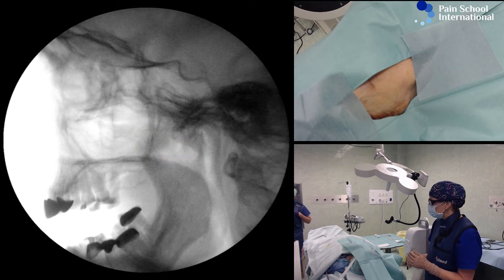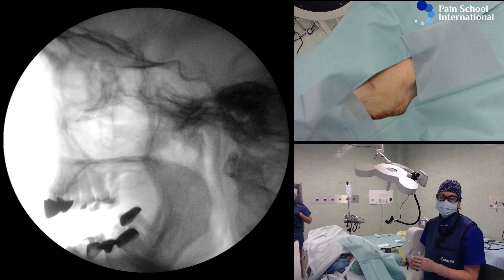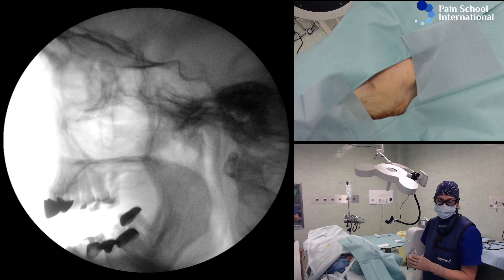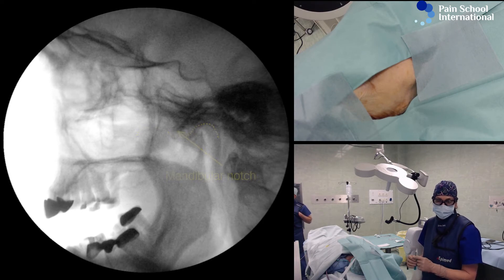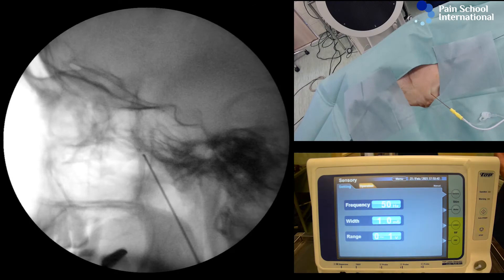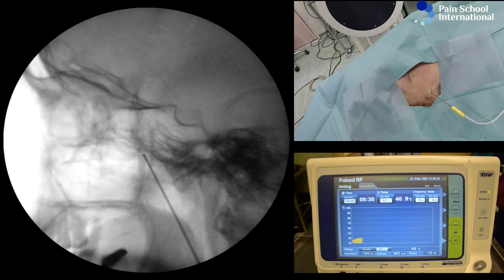So we have to stick with the traditional approach, where we enter the skin at the mandibular notch, which is visible on the x-ray right here. You can see we're doing it with 50 Hz, 1 millisecond pulse width. She feels it at the root of the nose, so that makes me very happy with this positioning.